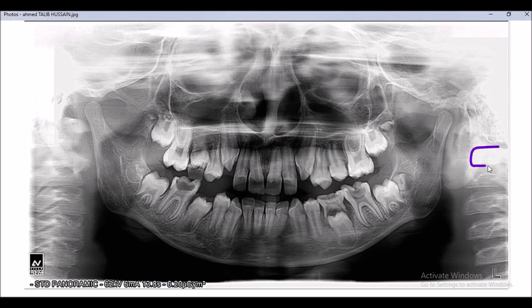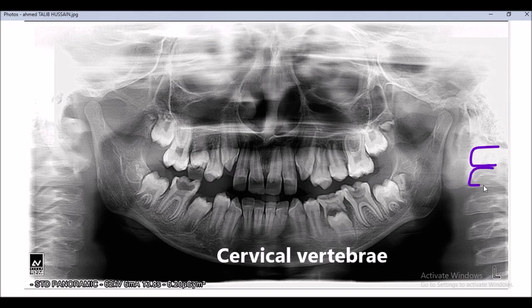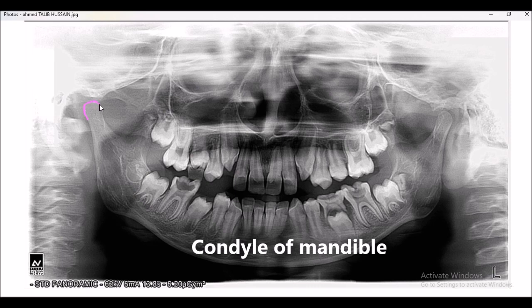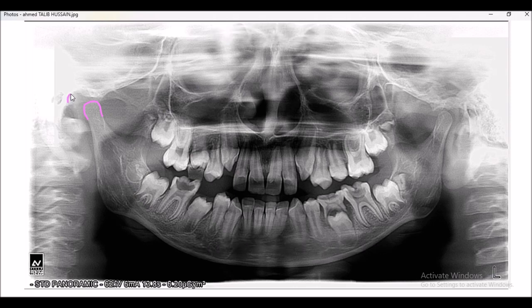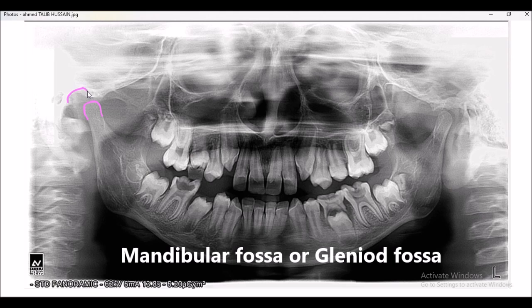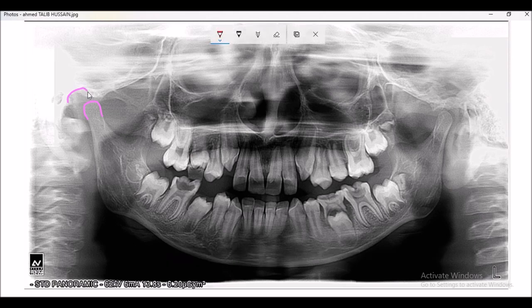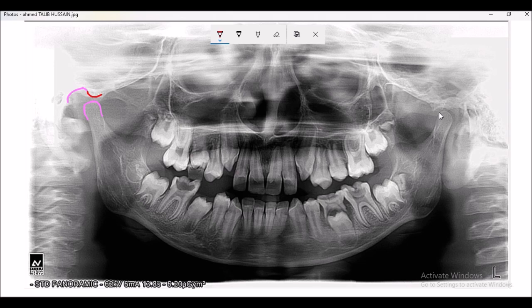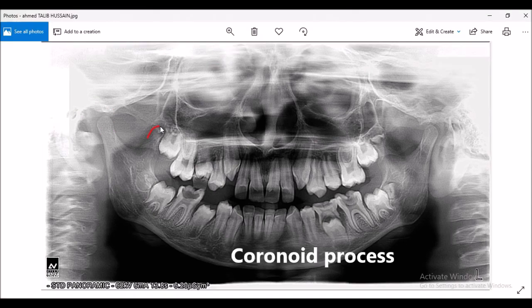These are the cervical vertebrae. This is the condyle of the mandible. This is the mandibular fossa, sometimes referred to as the glenoid fossa, and this surface is known as the articular eminence. This raised portion is the articular eminence, and this is the coronoid process.